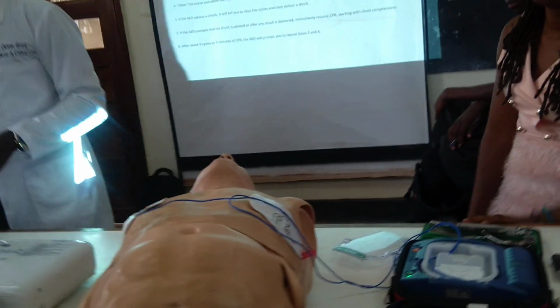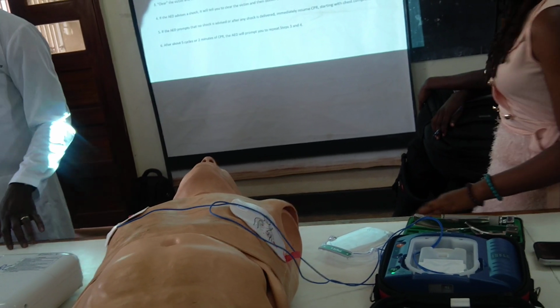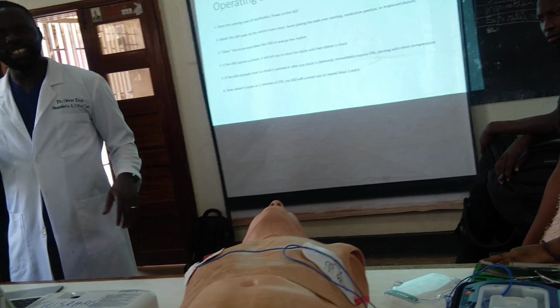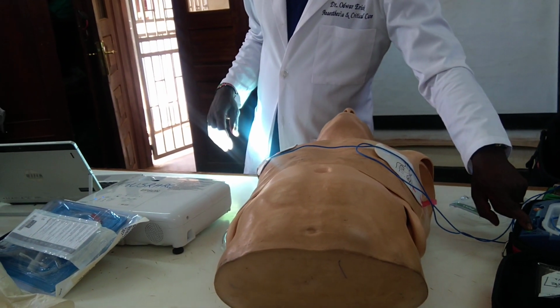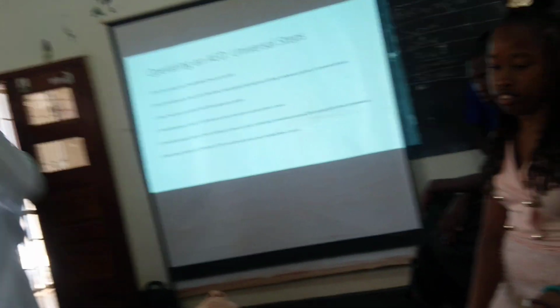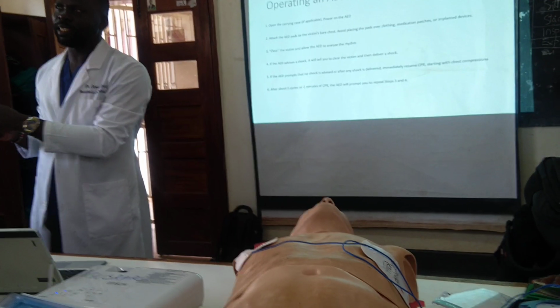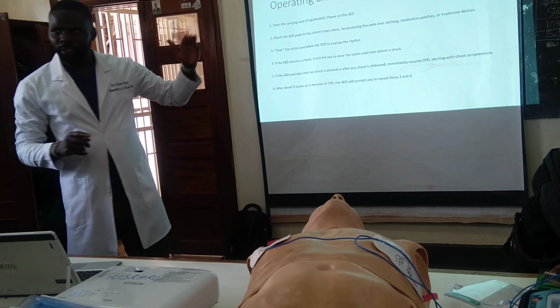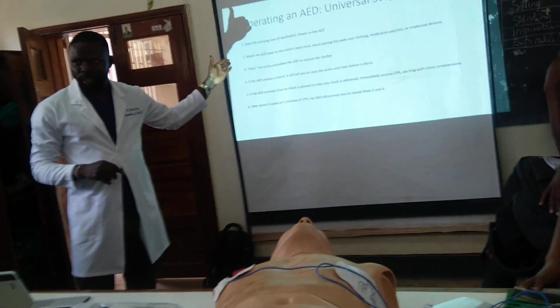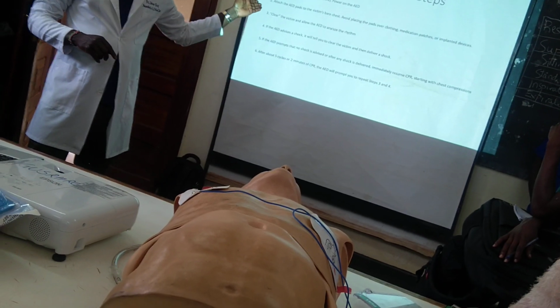This is automated. Now listen. He's asking what if he has the shockable rhythm? Have you looked at the chain of survival? Early recognition and prevention.